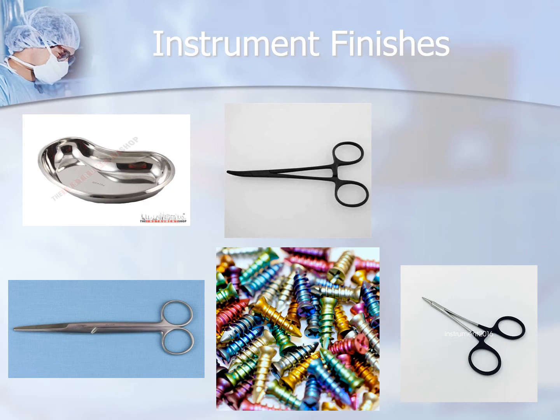What do you think this one is? The rainbow of fruit flavors. These are the titanium anodizing ones, right? Good for, typically use them for orthopedic implants such as plates or screws.